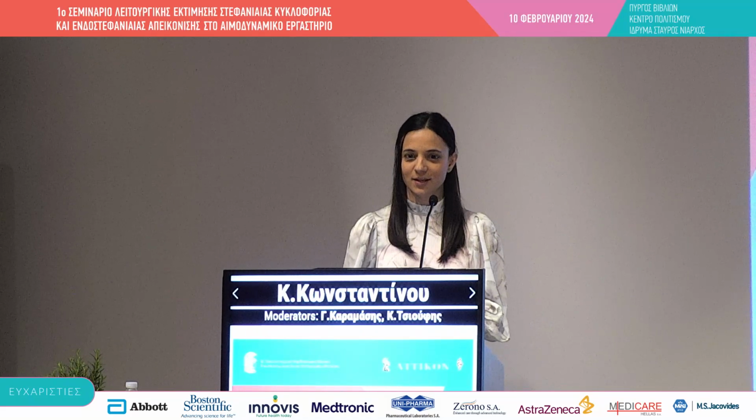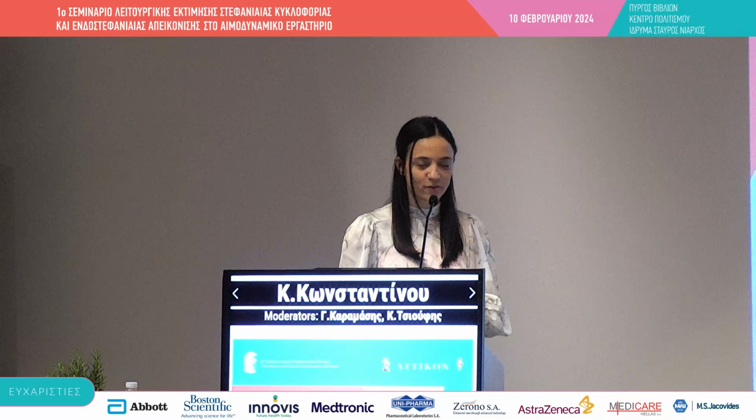So if we saw spontaneous spasm, we'd probably feel that it's not necessary to go ahead and give the boluses of acetylcholine. But I'm not sure anyone has tested these patients in a study to see whether they actually do develop spasm with acetylcholine. But you would probably be nervous to give a bolus of acetylcholine in someone who's got spontaneous spasm anyway.